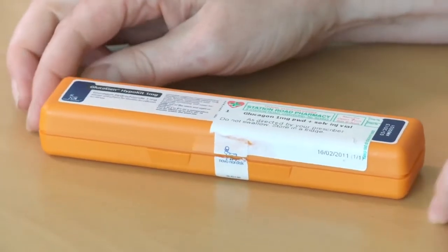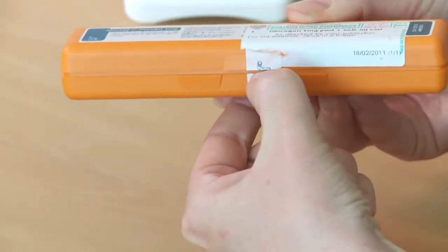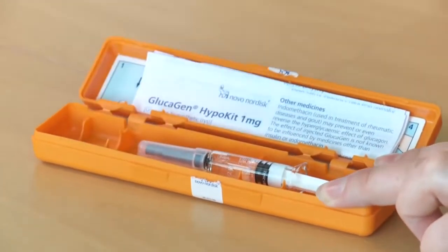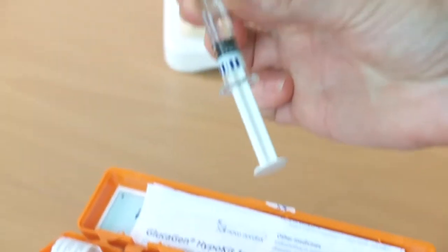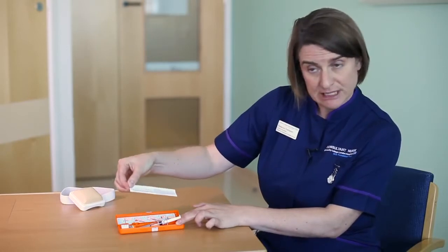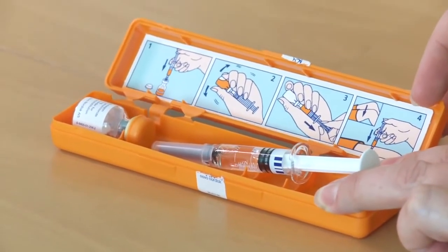This is the glucagon injection box. You can get this from your hospital or on repeat prescriptions from your GP. If you look at the box, it says glucagon hypokit, and there's also an expiry date on the front. To open the box, you slip the seal on the side. Inside the box you have a vial containing powder, a syringe containing water already drawn up for you, details about the drug, and pictures underneath to remind you how you're going to give that injection.